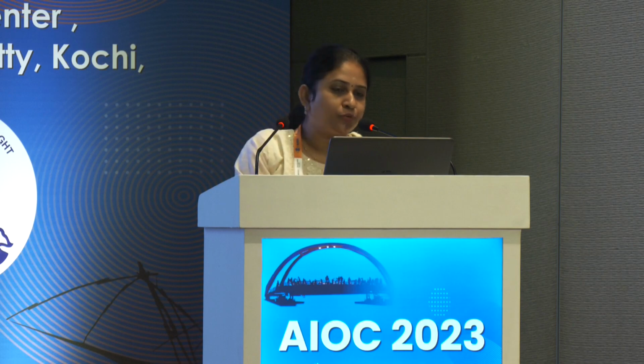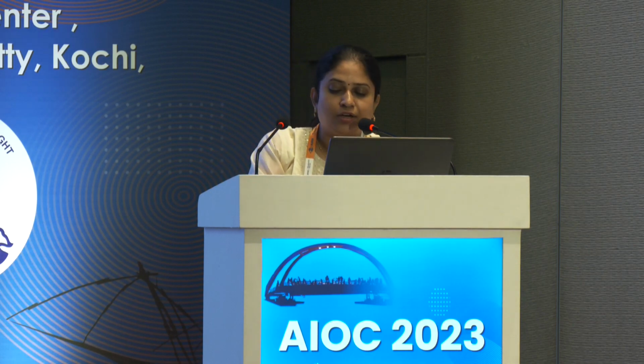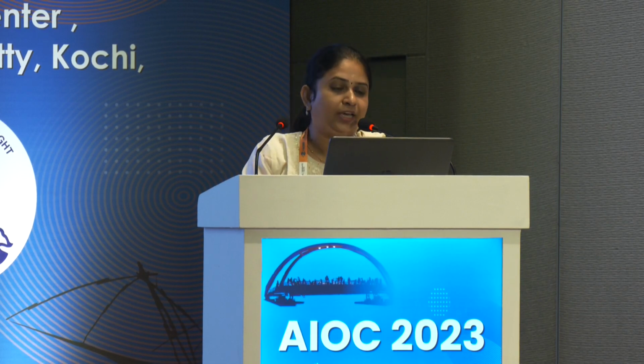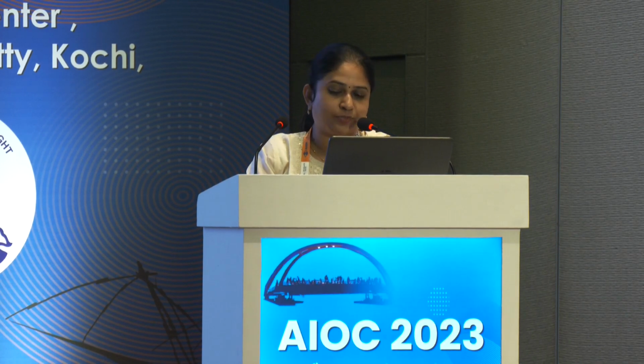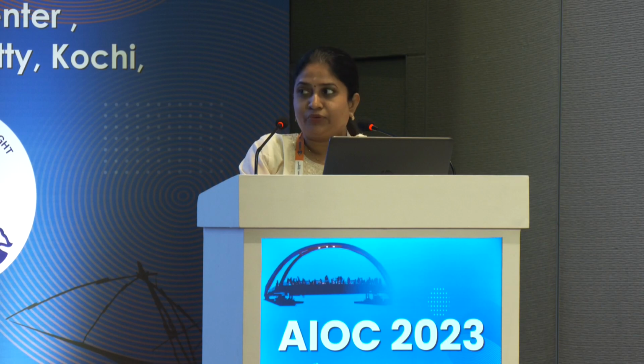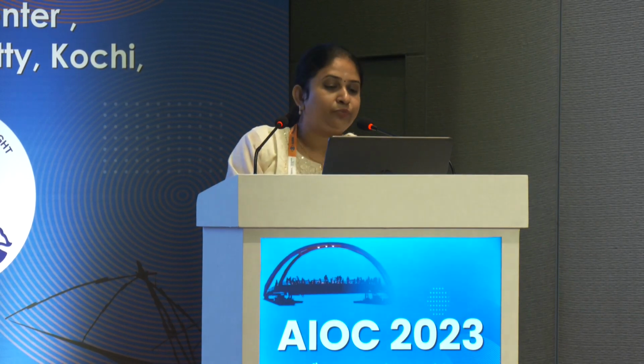Okay. So good morning, everyone. In this talk, I'll be covering some of the latest developments in the diagnosis and management of angle closure glaucoma. Gonioscopy continues to be the gold standard for diagnosing the presence of angle closure. It provides useful information such as presence of synechiae, pigmentation, and plateau iris. However, this is a highly subjective procedure.